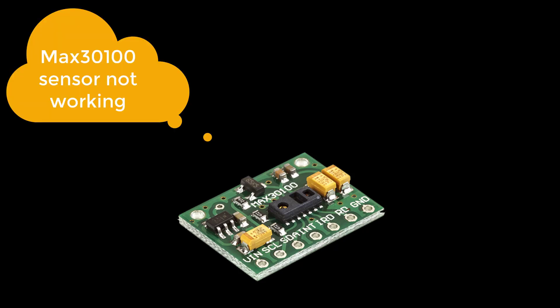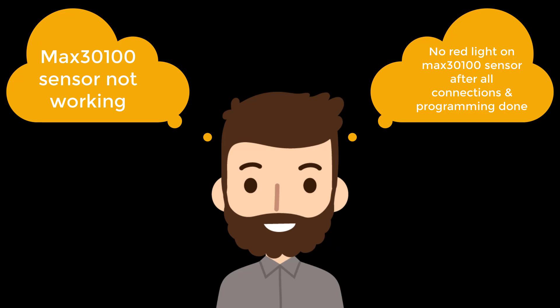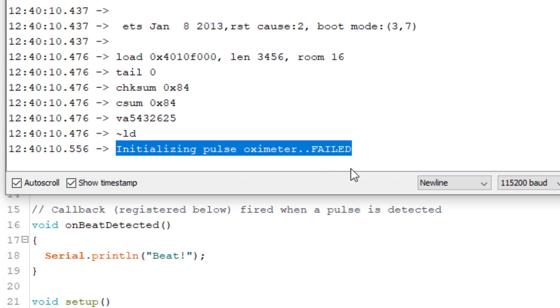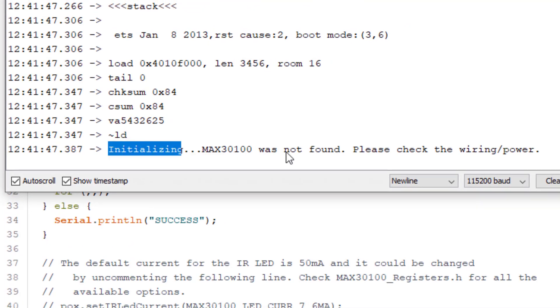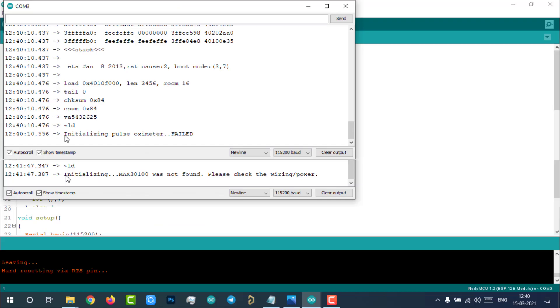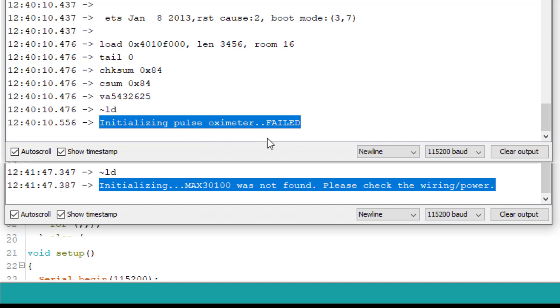MAX30100 sensor not working. No red LED on the MAX30100 sensor after all connections and programming done. If you are having a similar question in your mind, or your serial monitor is showing 'Initializing pulse oximeter... fail' or 'MAX30100 was not found, please check the wiring or power,' and you are looking for the solution, then you have stumbled at the right place. This video will help you solve all these issues.